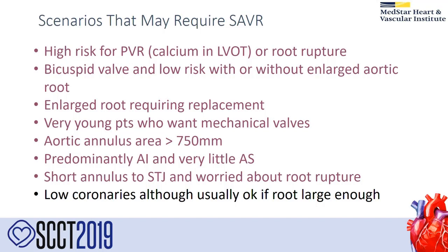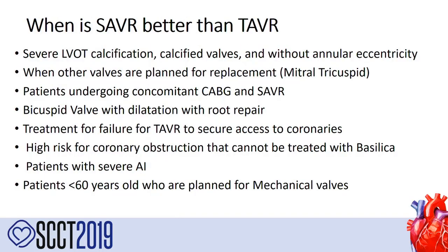So what we really need is to work together as a heart team and determine what is good for the patient. What are the things that we are still worried about? We are still worried about access to the coronaries in young patients. We worry about durability, but we don't have good durability data on the new surgical valves either, and that will come only with time. I think we also have to educate and get acceptance from the surgical team that they are part of this decision and part of this procedure to help us move to something less invasive.